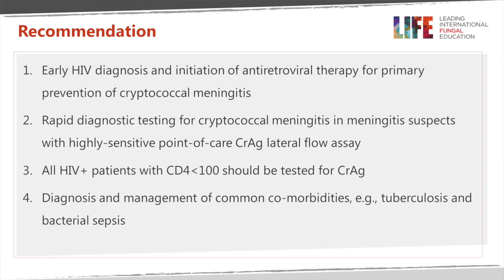Carry out this type of testing in patients who may have meningitis where you suspect the disease caused by Cryptococcus, and we do have this very sensitive point of care test, this lateral flow assay. The recommendation is that all HIV positive patients who have a low CD4 count should be tested for cryptococcal antigen using this lateral flow device, and of course we have to understand and diagnose the presence of comorbidities, for example tuberculosis and bacterial sepsis.